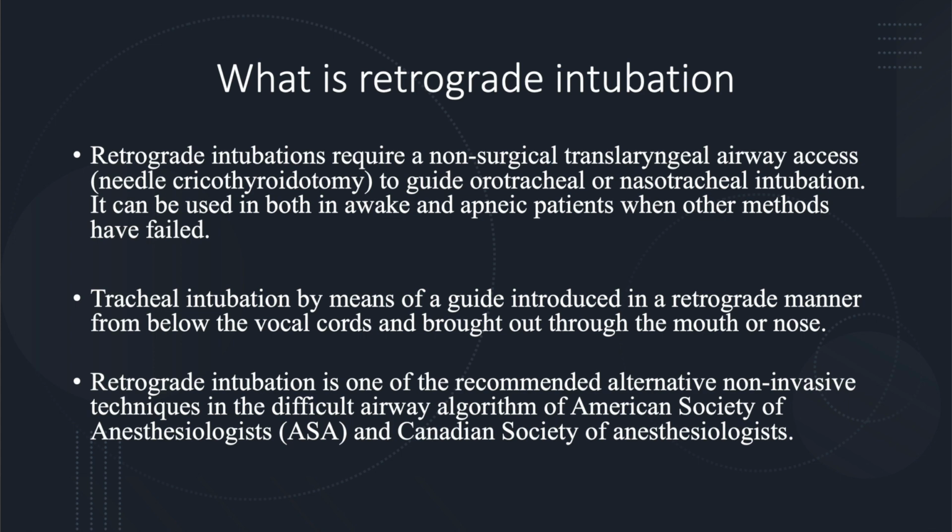And this method of intubation is an alternative non-invasive technique used in difficult airway algorithms, and it is recommended by the American Society of Anesthesiologists and the Canadian Society of Anesthesiologists.